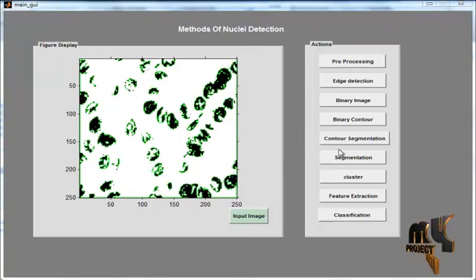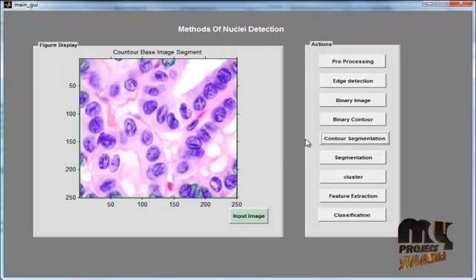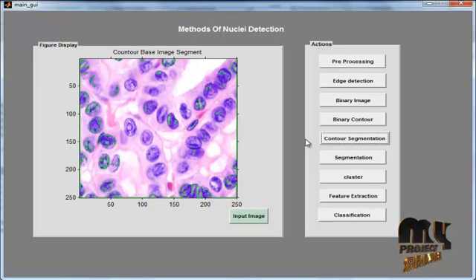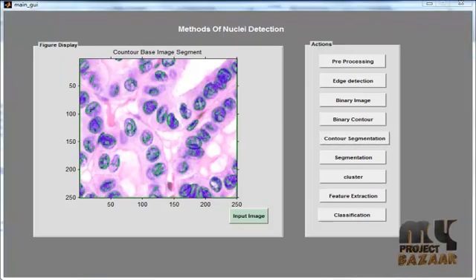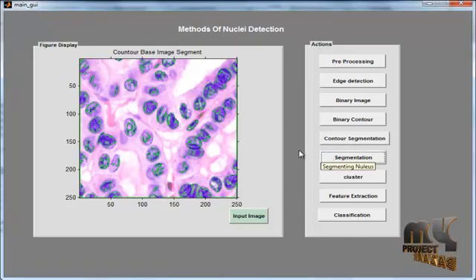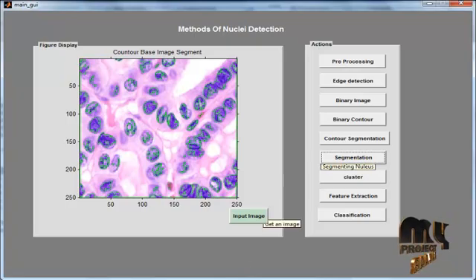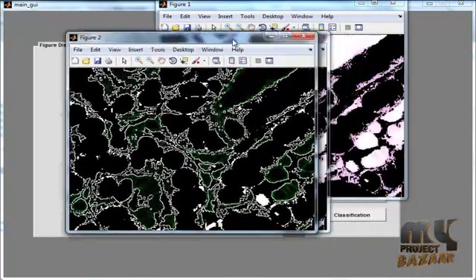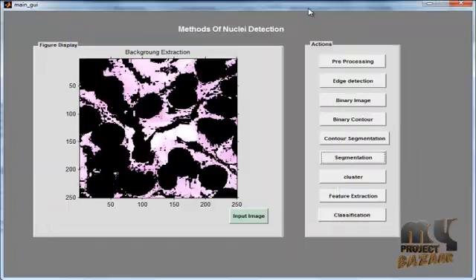Then click the Contour Segmentation button. The contour segmentation will be applied to the original image. First, we can see the contour segmentation on the binary image, and then we see the contour segmentation on the original image. Now click the Segmentation button. After clicking Segmentation, we can see the segmented images in the figure and also in the axes.